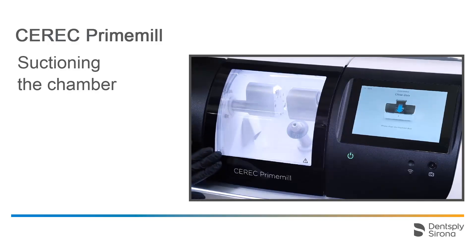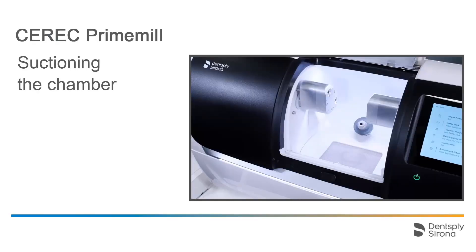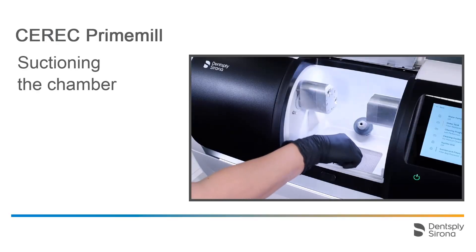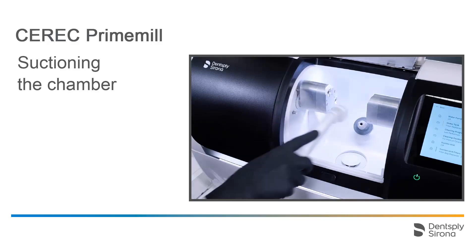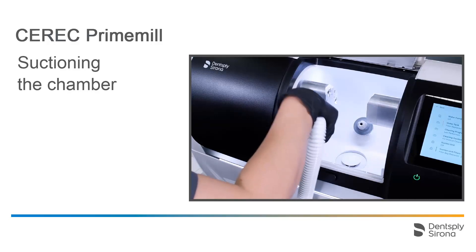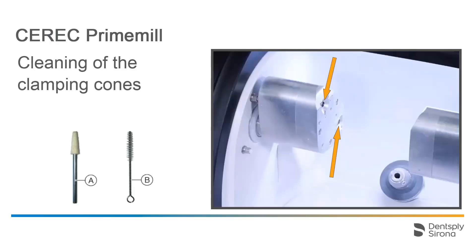We close the chamber and the motors and workpiece axis move back to their starting position. The screen can also be removed for cleaning so that the chamber floor can be suctioned out. It is also recommended to clean the clamping cones with the instruments shown here; they are included in the delivery. Start with instrument B for rough cleaning, then use instrument A.